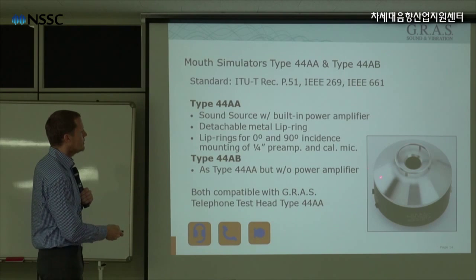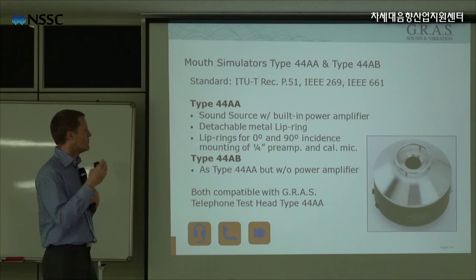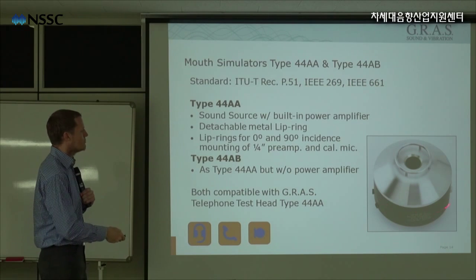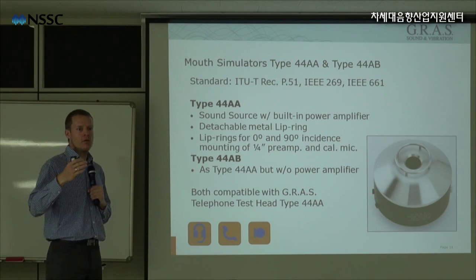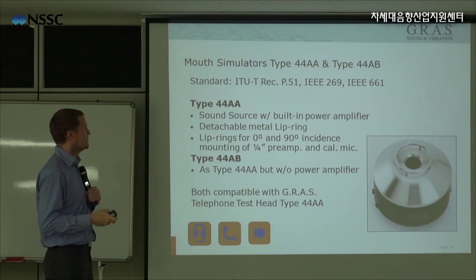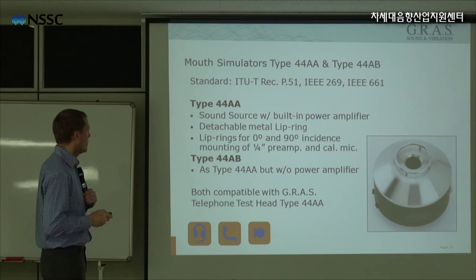What you see here is, you can say, this is the skin or the cheek side, and the ring on top is reflecting the lip of the mouth. So this is a standardized mechanical mouth. Inside you have a speaker that delivers a sound signal that is suitable for testing telephones and speakers and headsets and different kinds of equipment.